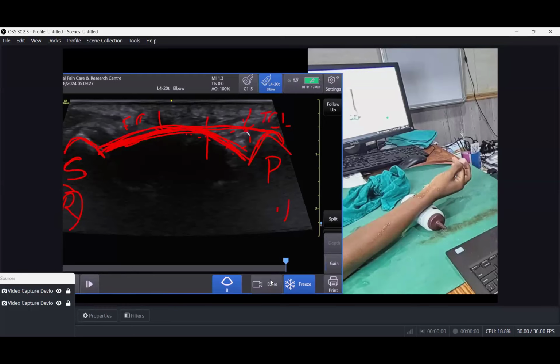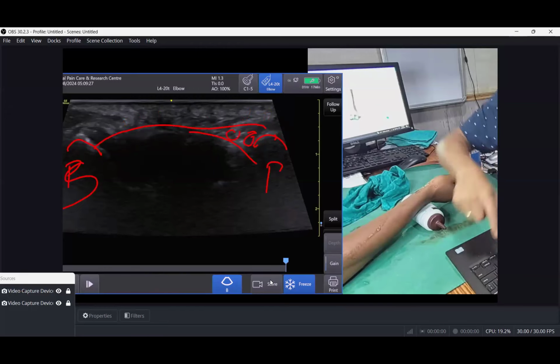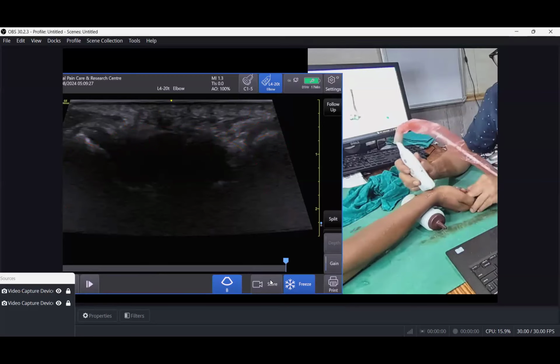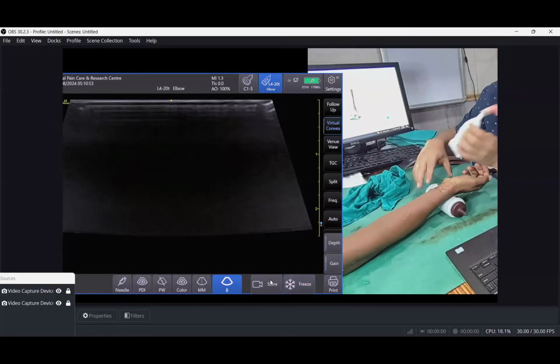And here will be the ulnar nerve. And this is Guyon's canal, where there is the ulnar nerve and ulnar artery. Okay, so I'll be demonstrating this to you very nicely. Pisiform, scaphoid, pisiform, flexor retinaculum dividing into two, incorporating the ulnar nerve and ulnar artery. Let's see this very nicely now. And you can see below this will be the median nerve, and there will be 9 tendons here. Okay, so let's start this scan. Okay, I'm again starting from the home page.